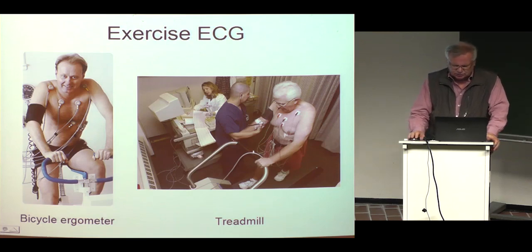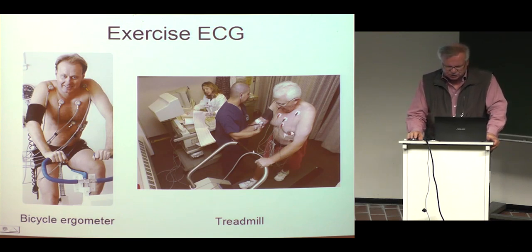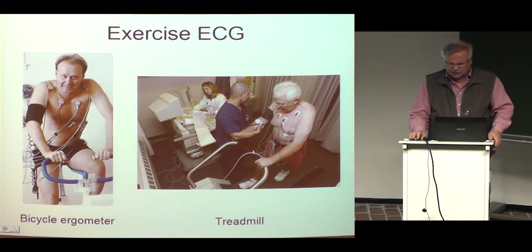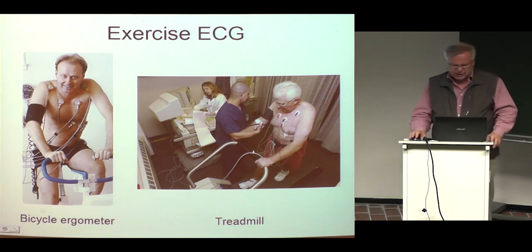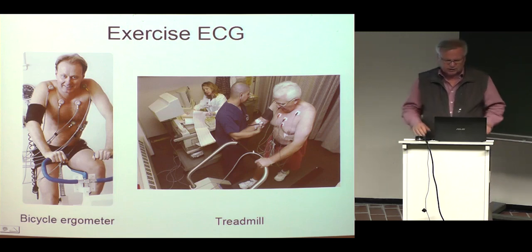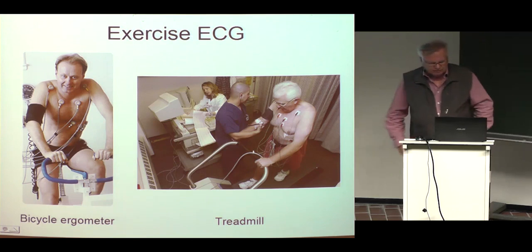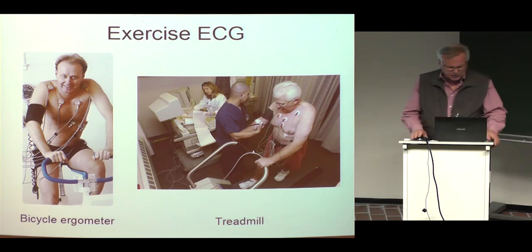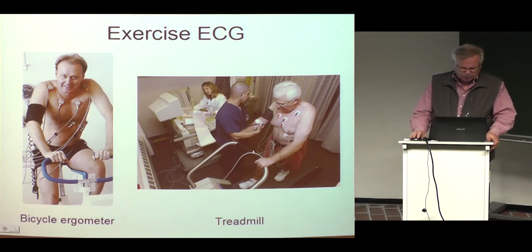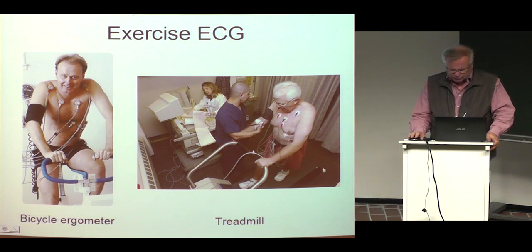that if there is a high body weight, if it's a very heavyweight patient, then the standard walking is more stressing to such a patient than biking, because the patient needs to carry the body weight during the exercise. So that is the main difference. And then there's a geographical difference. The bicycle ergometer is used in most parts of the world, but the treadmill is used especially in the United States. Why? I don't know. Historical reasons.